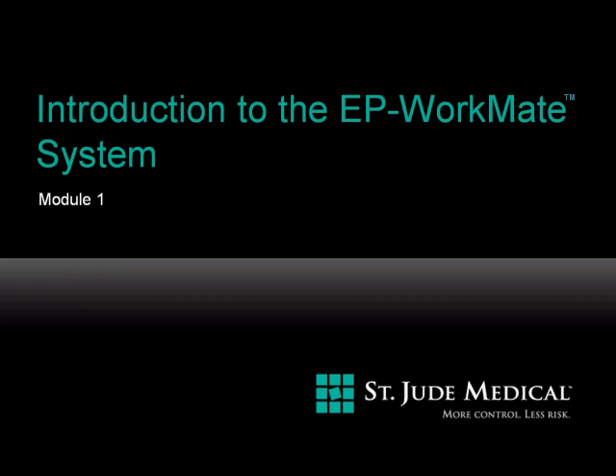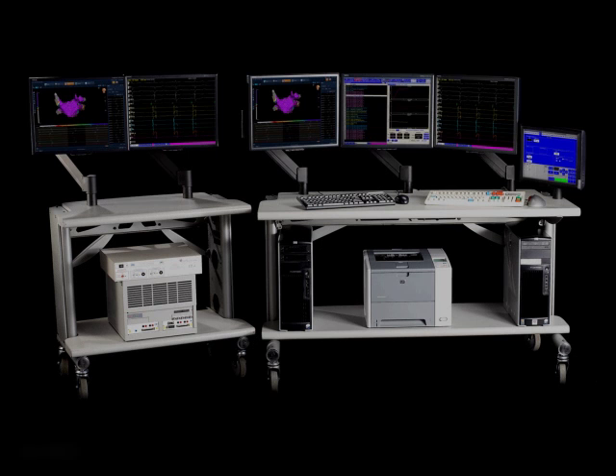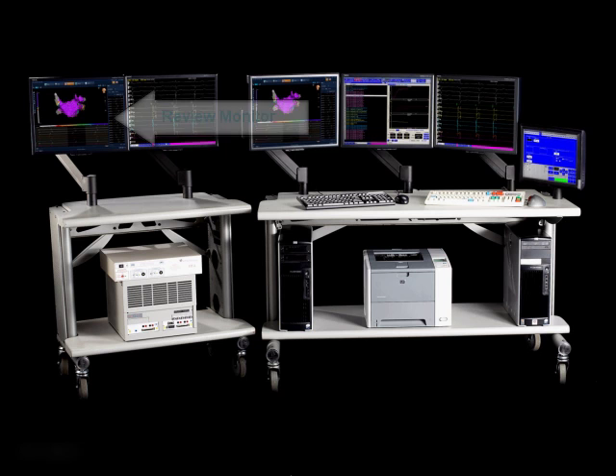This is Module Number 1, Introduction to the EP Workmate System. The EP Workmate Recording System is a dual monitor EP recording system with one monitor for reviewing signals and one monitor for the display of real-time signals.